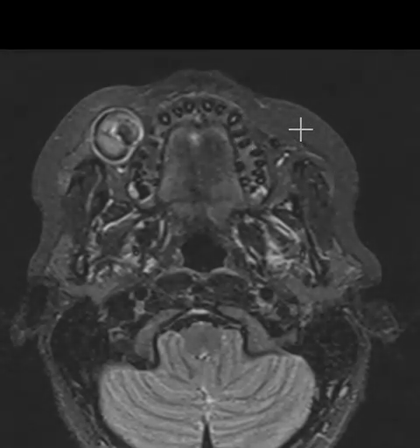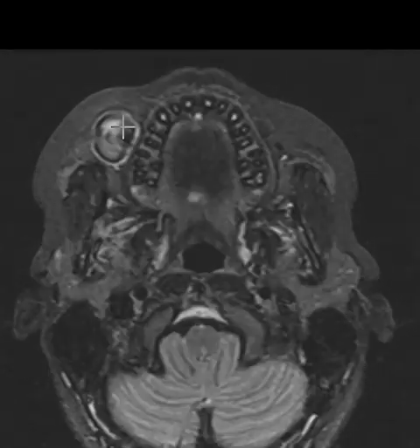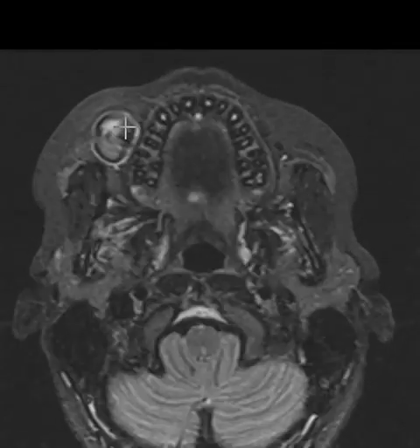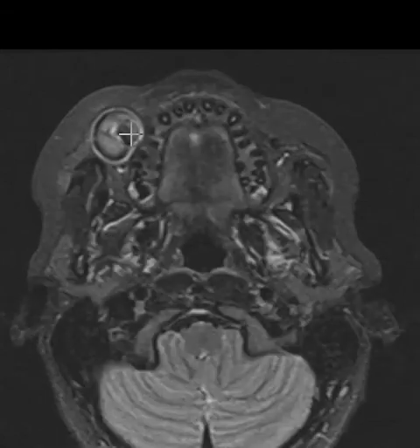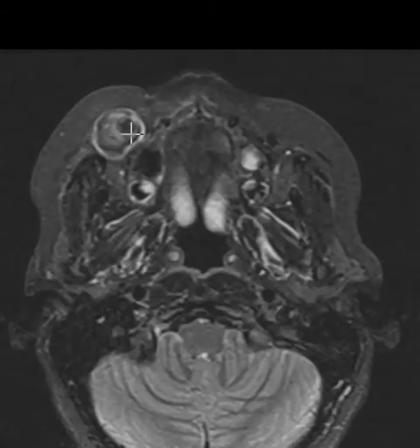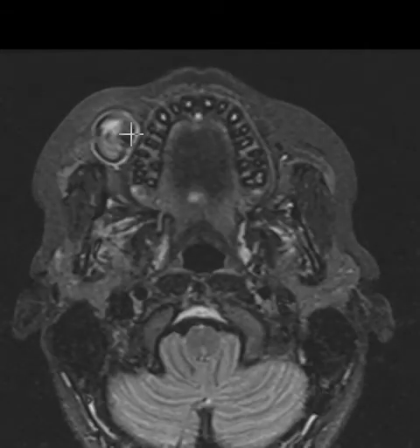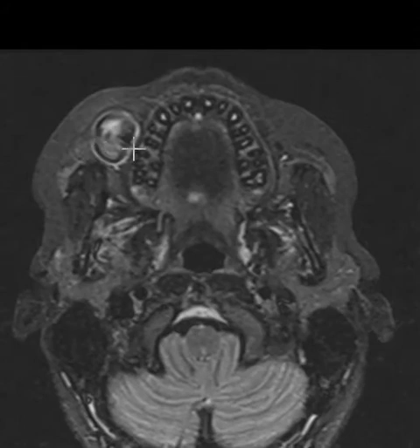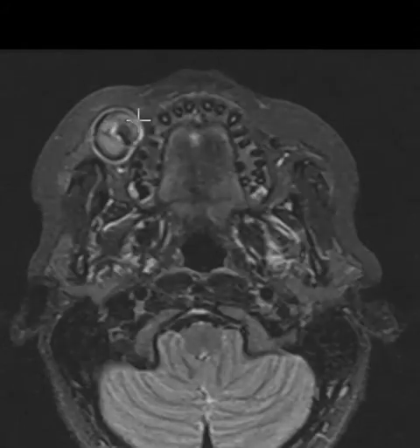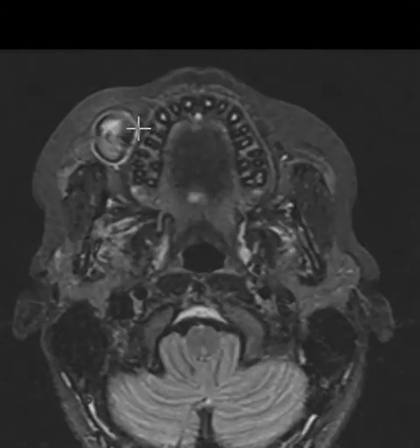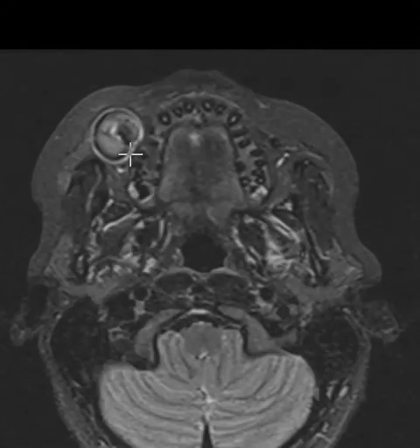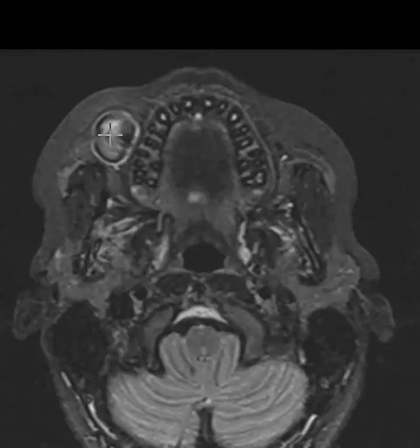So we see that these areas that were bright before are pretty dark, so this means that they are collections of fat. And in a young person like this, when we see a lesion with really well-defined margins, it has some fatty components and some solid components, or even fluid components. This is typical for a dermoid, which is a benign tumor.